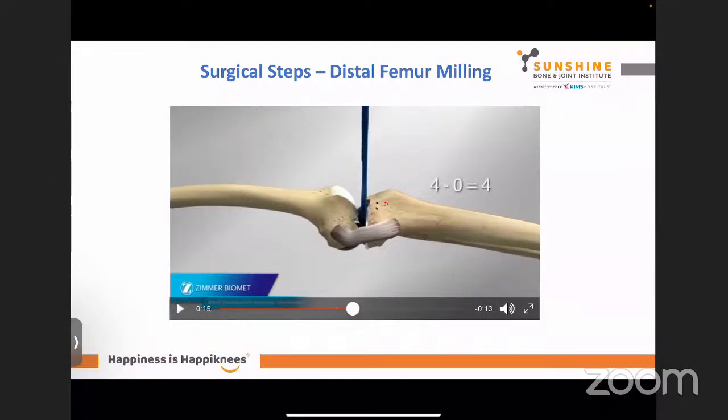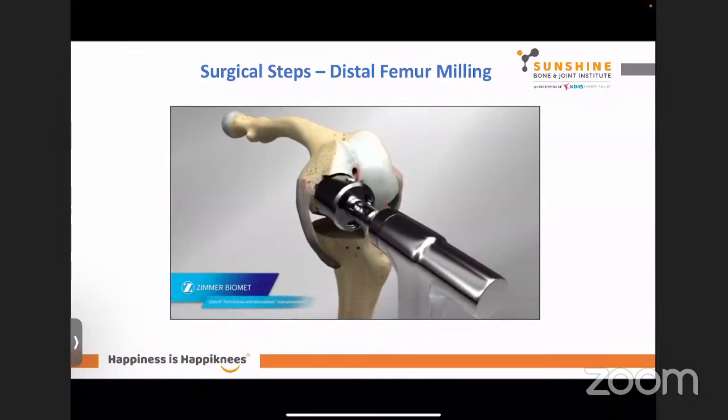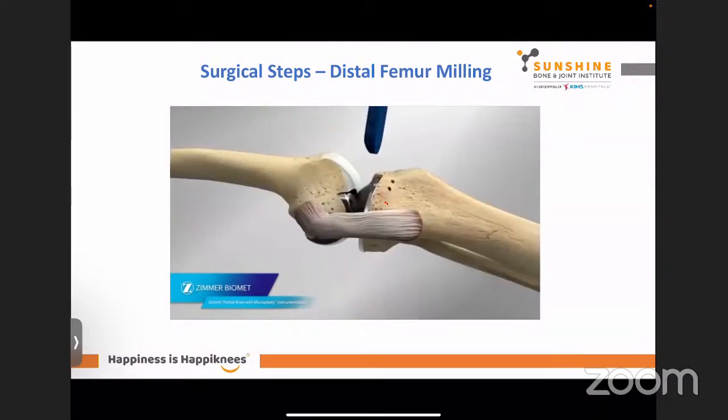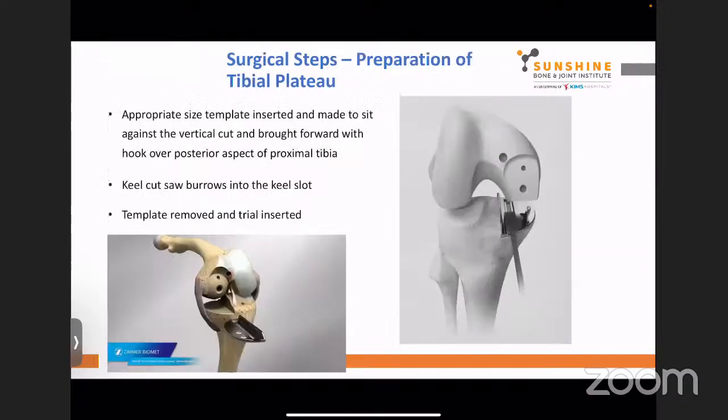So now understand this. Your flexion gap is 4. Your extension gap is 0. So how much more you have to mill to balance the two? 4 minus 0, which is equal to 4. So you need to mill your distal femur 4 millimeters deeper. So what you do, you take a 4 spigot, which allows your mill to go even deeper than before, and you mill out the remaining part of the distal femur. And now you can get a feeler gauge of 4 in flexion, and the same 4 size should go in extension as well. Now it's beautifully balanced in flexion and extension. That's how you balance your flexion extension gaps in an Oxford joint.